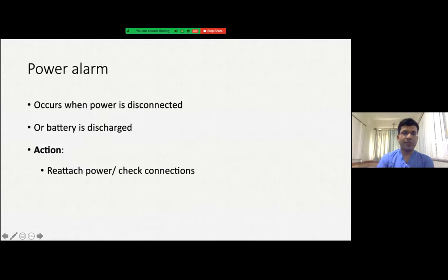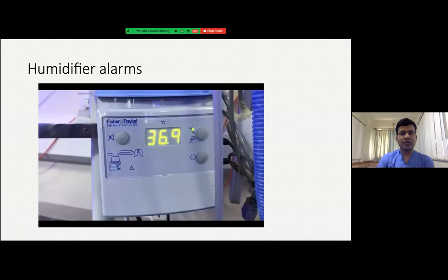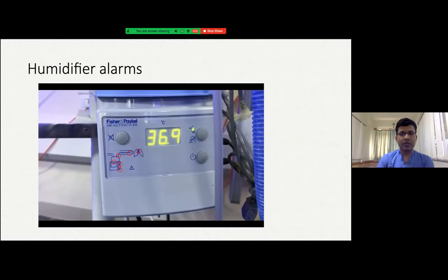A power alarm occurs when power is not connected or the battery is discharged — this can be an emergency as it can result in ventilator shutdown and must be corrected immediately. The humidifier has 6 alarms: for the heater adapter, heater wire, heater plate, proximal temperature sensor, distal temperature sensor, and airway. I will show each alarm and how to troubleshoot them.